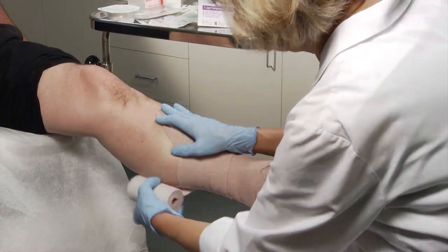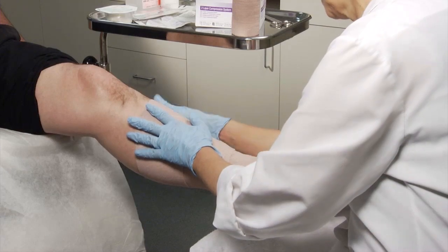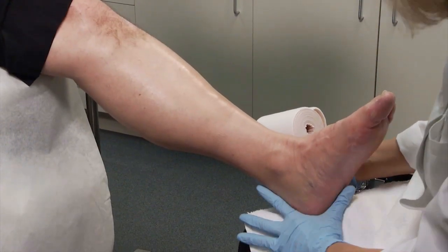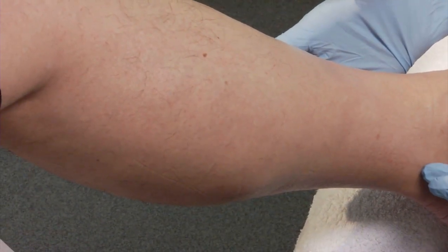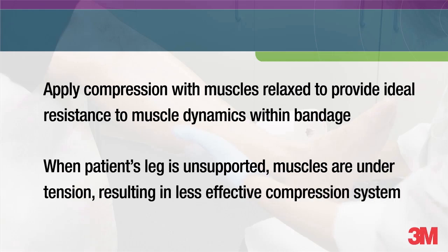When applying the comfort layer, the goal is to create an anatomical fit around the leg, covering all the skin and leaving no gaps with as thin a layer as possible. Position your patient comfortably with the calf muscle relaxed and the foot supported in a 90 degree dorsiflexed position. You can accomplish this by supporting the knee off the bed or with the leg hanging freely. Applying compression with the muscle relaxed results in a firm inelastic sleeve that provides the ideal resistance to the muscle dynamics within the bandage. When the patient's leg is unsupported, the muscles are under tension, resulting in a less effective compression system.